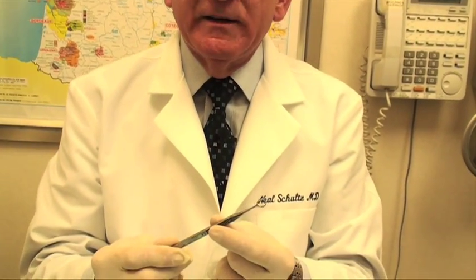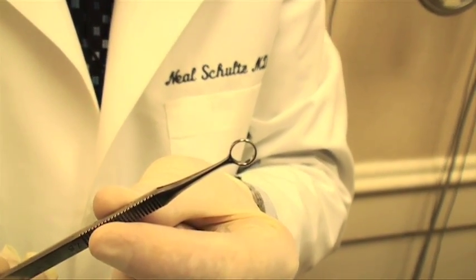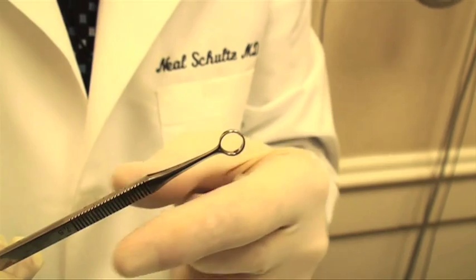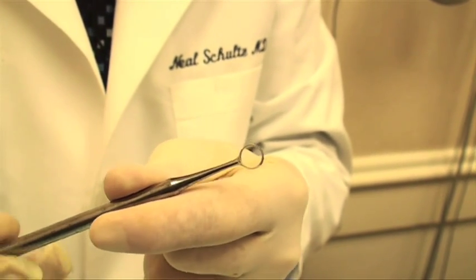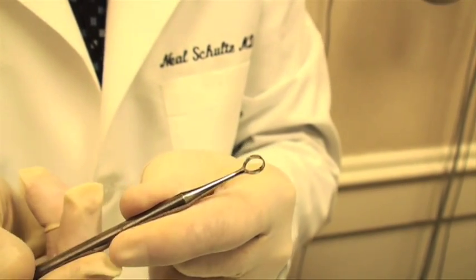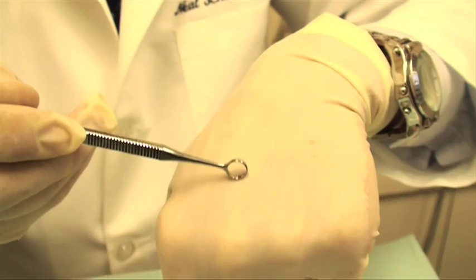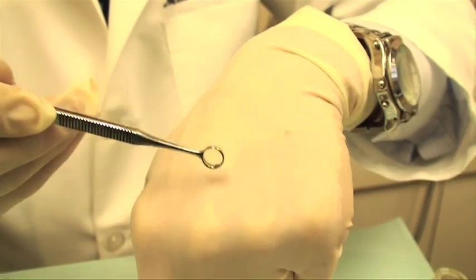Then it's time to take an instrument and scrape off the wart or the growth. The most common instrument we use is called a curette. A curette is really a circular or a round knife. This is the back of it and it's kind of blunt, but this is the front, and the front of the curette is this round, very sharp edge. And with that, if there's a bump on my skin and I start to scrape, that bump will come off, whether it's a wart or a mole.